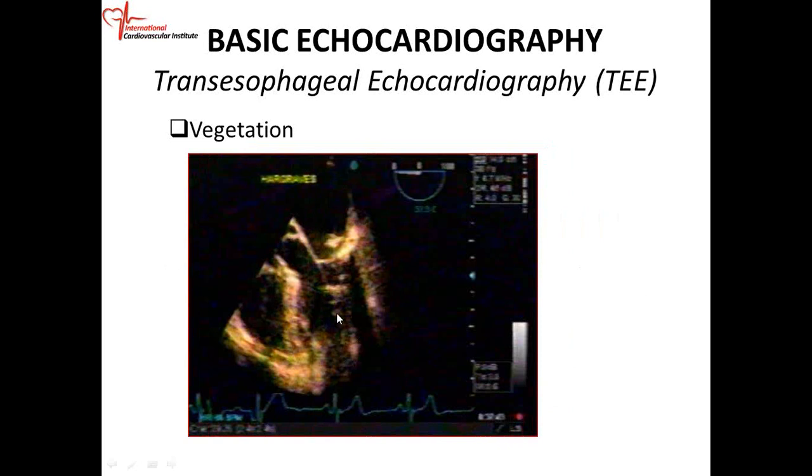When we did the transthoracic, we weren't clear what was going on, but when we did the transesophageal, the semicircle at 0 degrees, she had endocarditis, with vegetation not only on the mitral valve but also on the aortic valve, and a piece of that vegetation on the aortic valve embolized into her coronary arteries, and that's how she got the heart attack.